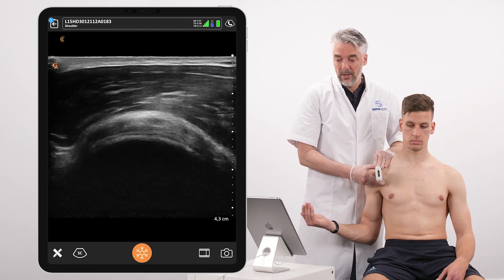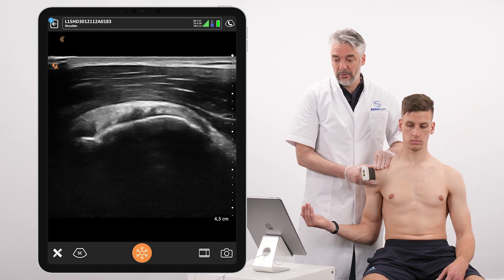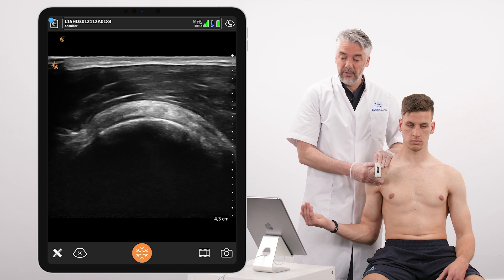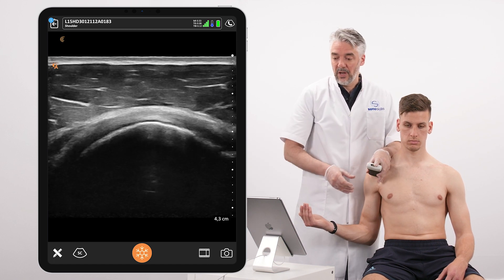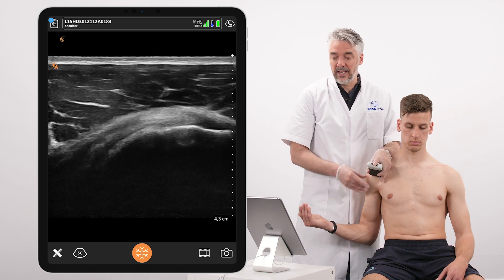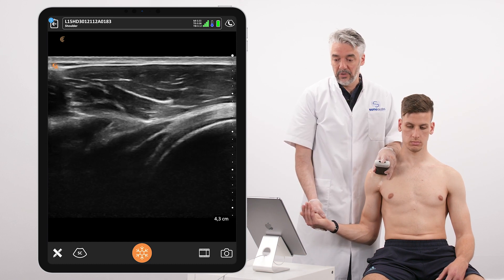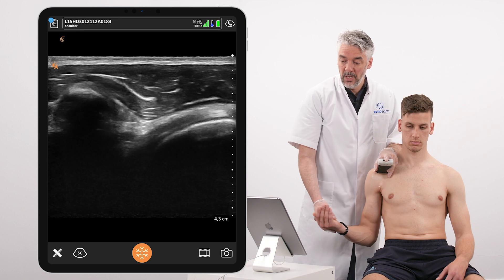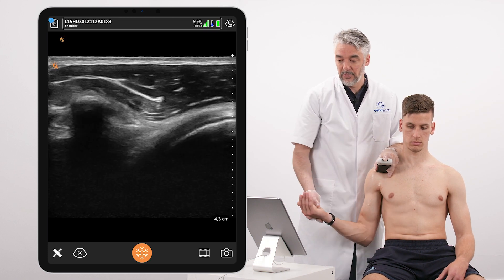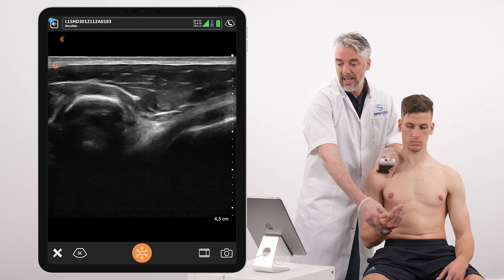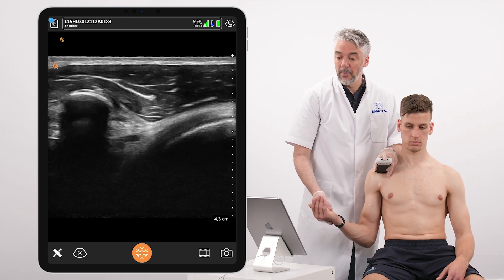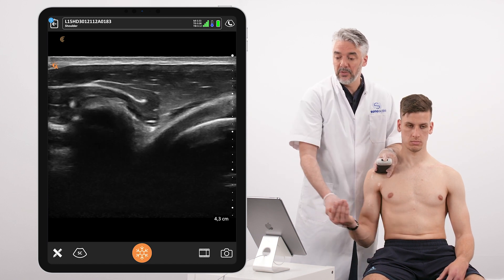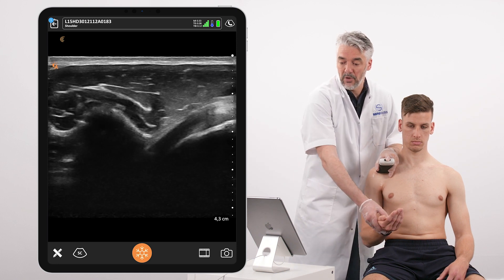Scanning from medial to lateral allows visualization of all tendon fibers inserting to the lesser tubercle. Following the subscapularis in the longitudinal plane back to the coracoid process, we search for subcoracoid impingement by performing internal and external rotation movements and looking for fluid collections that may emerge from underneath the coracoid process, as well as impingement of the subscapularis and bursa at the level of the coracoid.